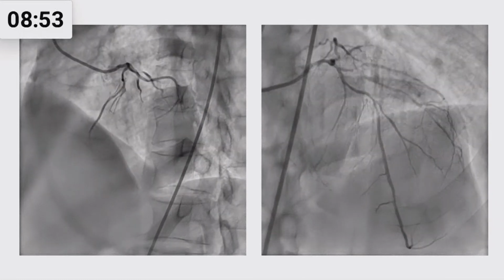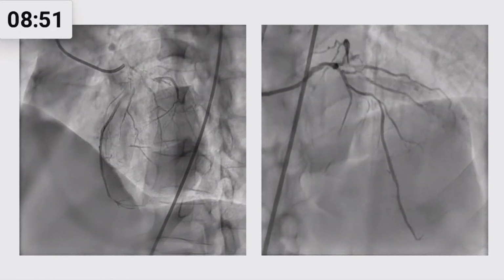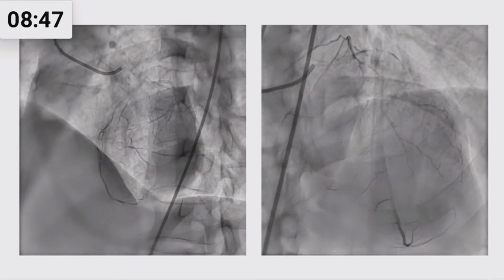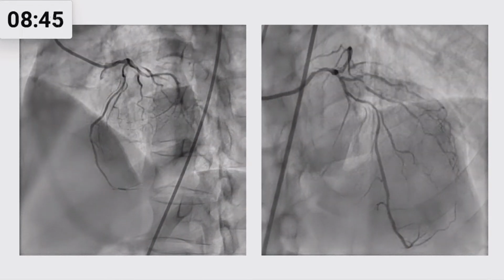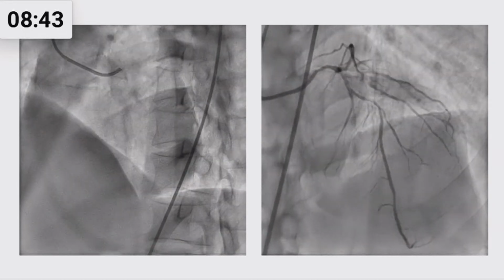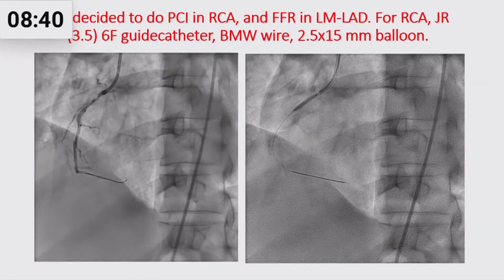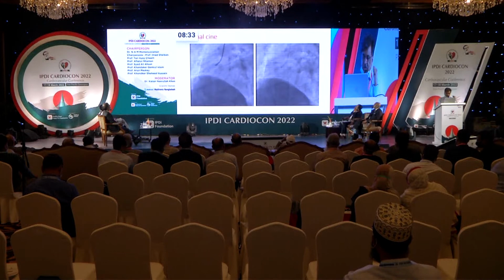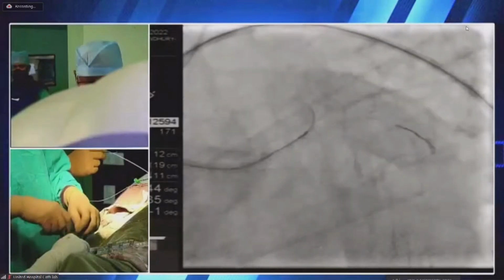So we are planning to do angioplasty, but the problem is that the patient has renal failure and COVID pneumonia. It does two things, so dye is an important factor here. So we use not zero contrast, but minimum contrast. We do the RCA first.